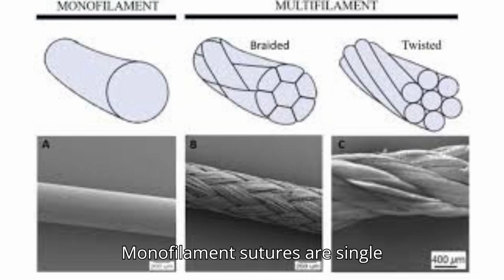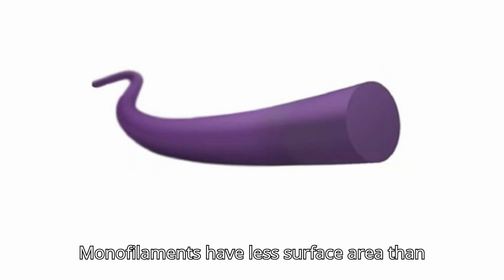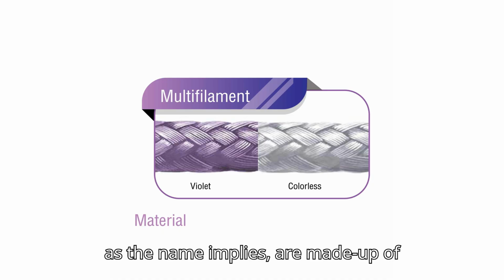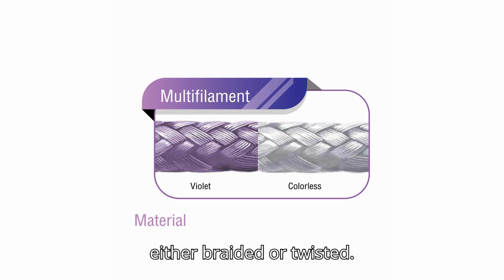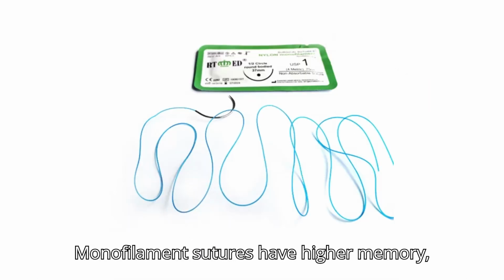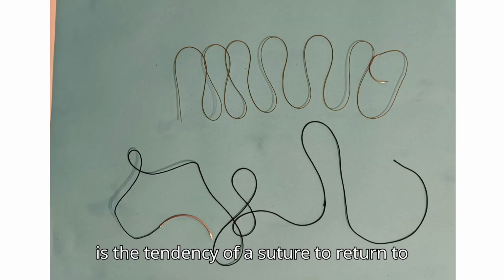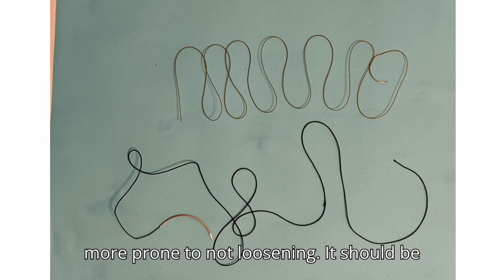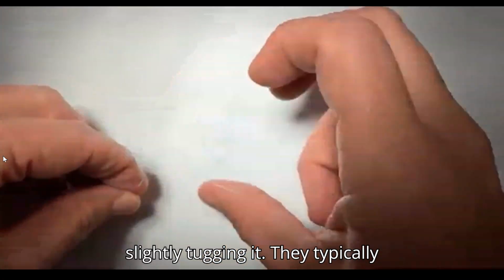Monofilament sutures are single filaments, as their name implies. Monofilaments have less surface area than multifilaments. Multifilaments, as the name implies, are made up of multiple filaments. These filaments are either braided or twisted. Monofilament sutures have higher memory, which demands more handling care. Memory is the tendency of a suture to return to its original shape and makes the suture more prone to knot loosening. It should be addressed by holding the suture and slightly tugging it.